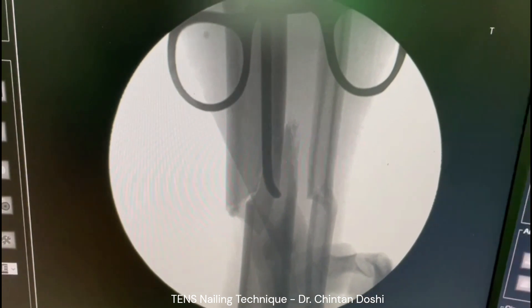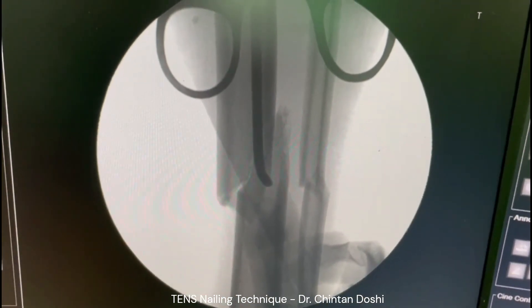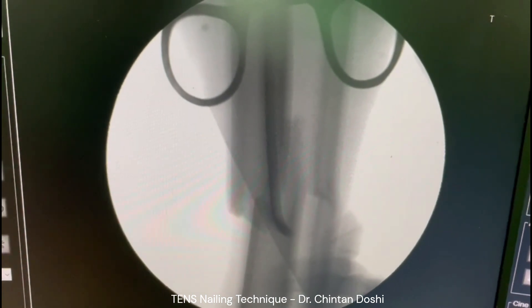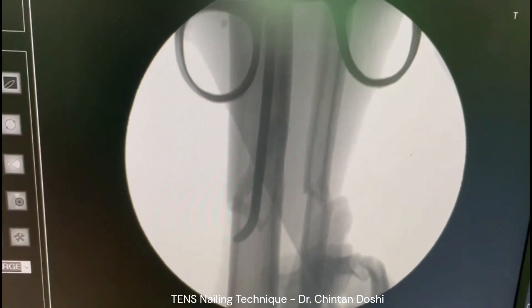Introduce one nail into the distal fragment first for reduction. The tip of the nail is advanced into the distal fragment and can then be turned around to achieve reduction as shown.